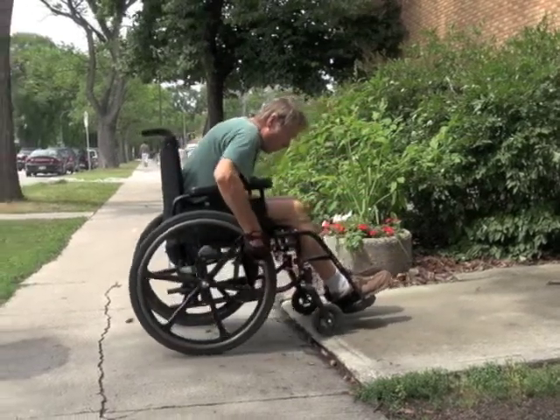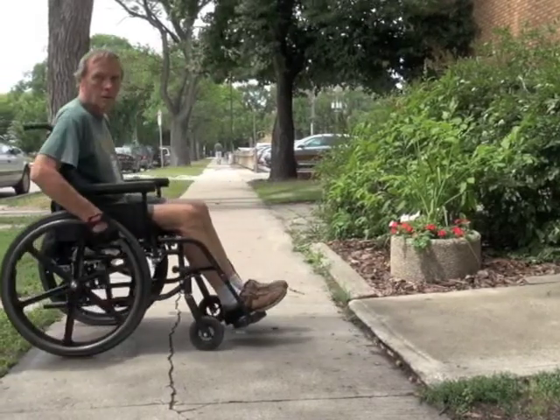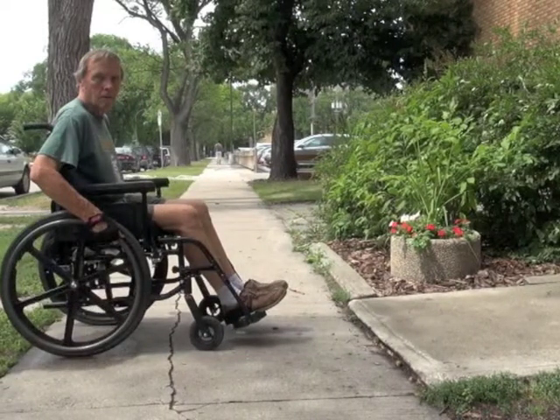Still leaning far forwards, continue to roll the chair backwards until the casters drop down to the lower surface. Be careful that your foot rests do not get caught on the higher surface.